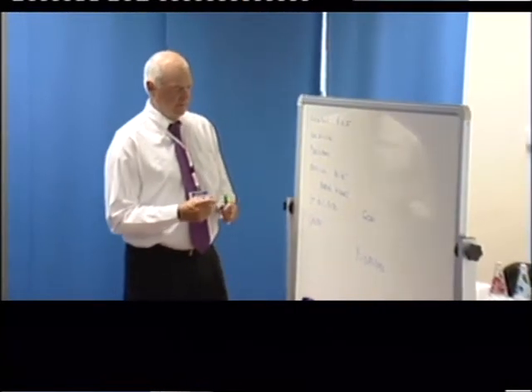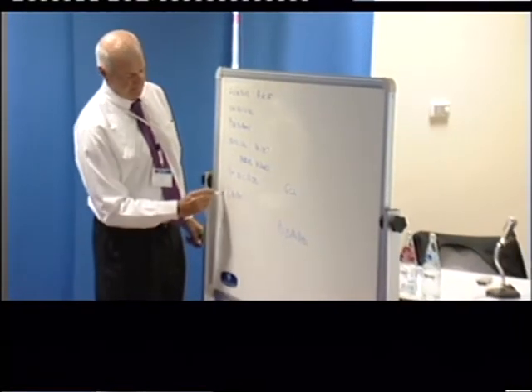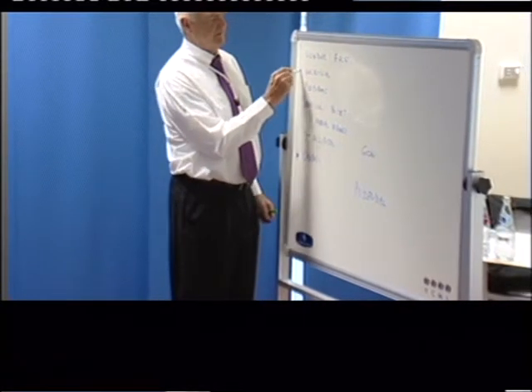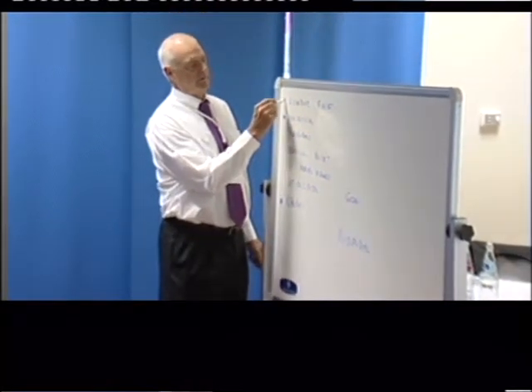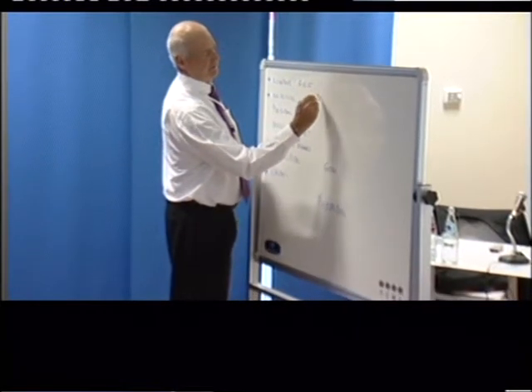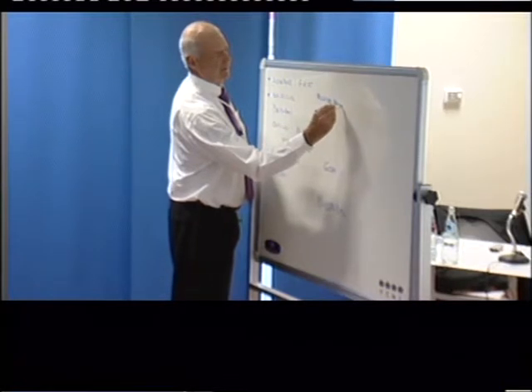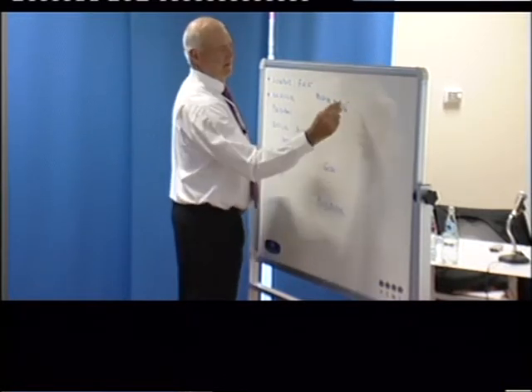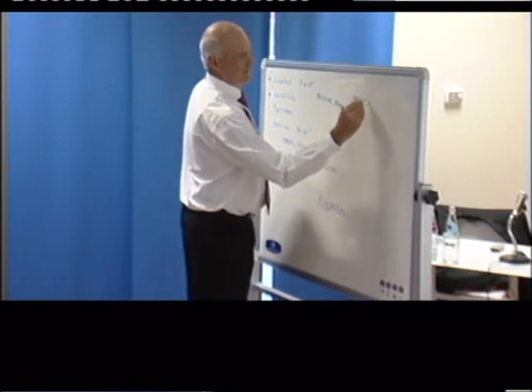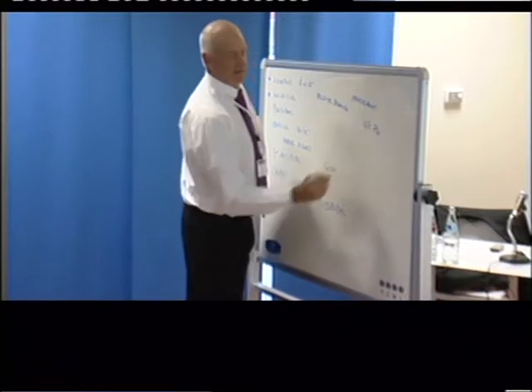I think you saw some caudal, a little bit of caudal. I saw a little bit of sacroiliac joint. We saw some lumbar facets, some medial branches, some nerve roots, and some lumbar plexus.